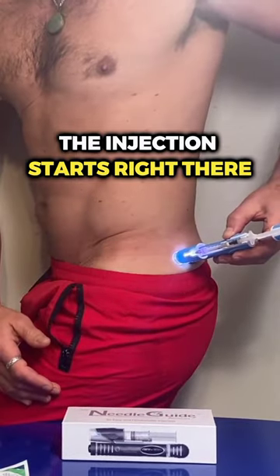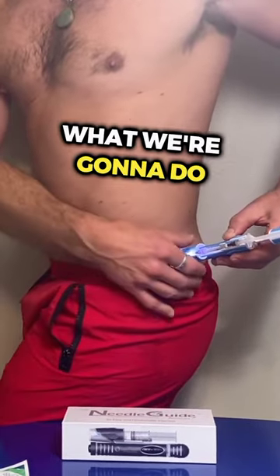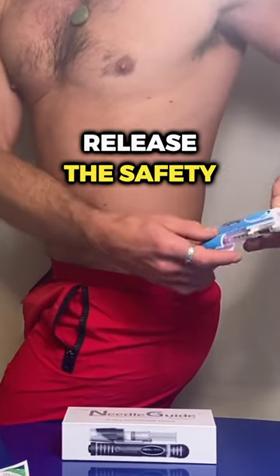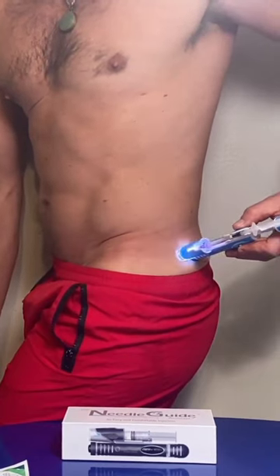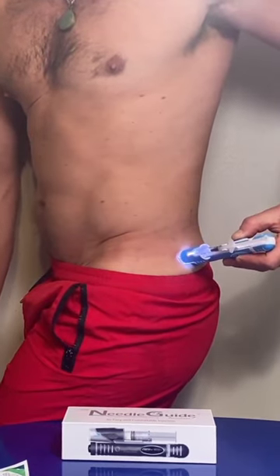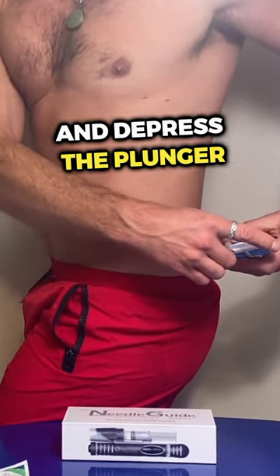The injection site right there — see the light goes on? What we're going to do is release the safety, so now it's green, hit the button, and depress the plunger.